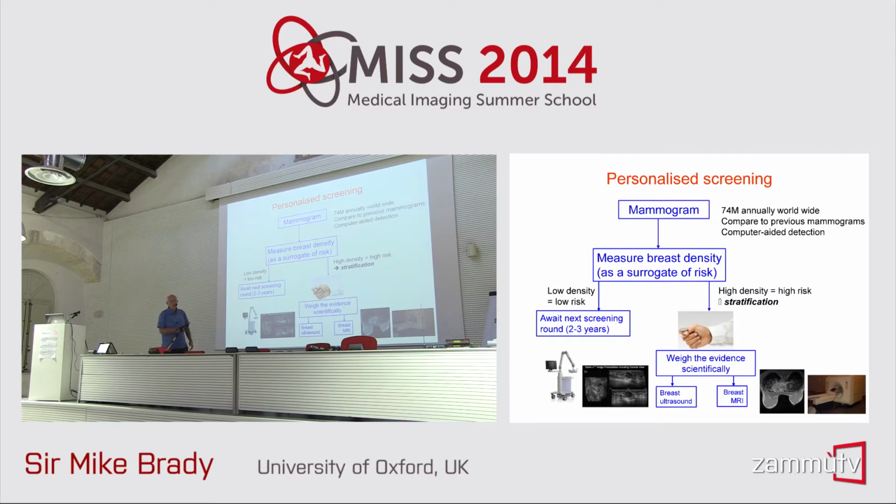So why mammography? Well, a woman's breasts, fundamentally until the menopause, have a major functional role, which is to produce milk in order to suckle infants. I realize that for the National Enquirer and for the Sun, that comes as a deep shock, right? But fundamentally, the role of the breast is to produce milk. Milk is fundamentally opaque to x-rays. They absorb it.